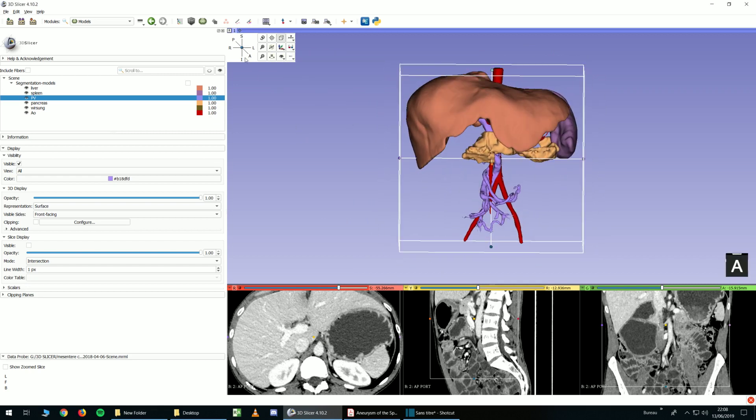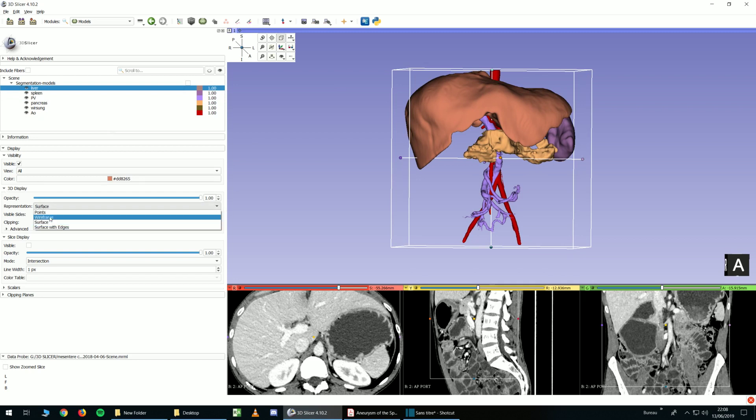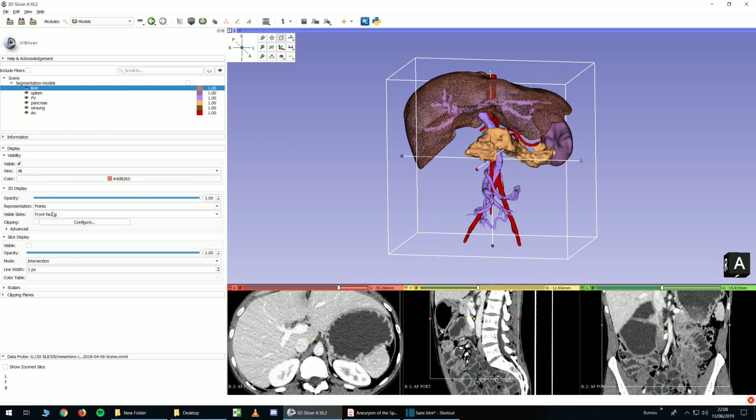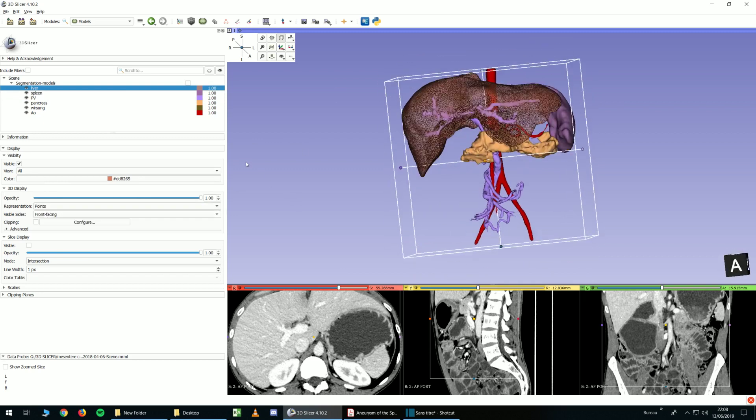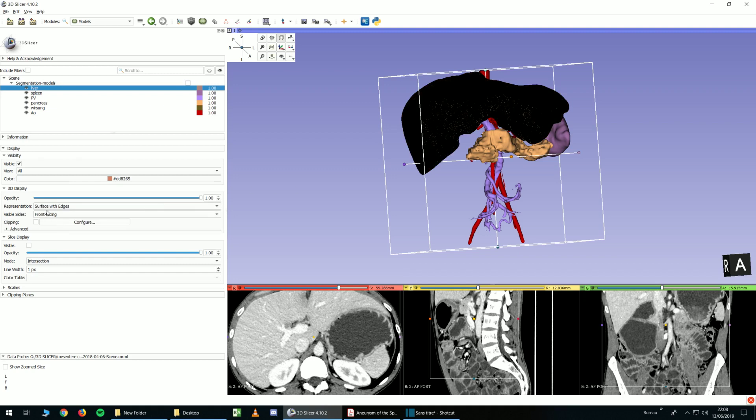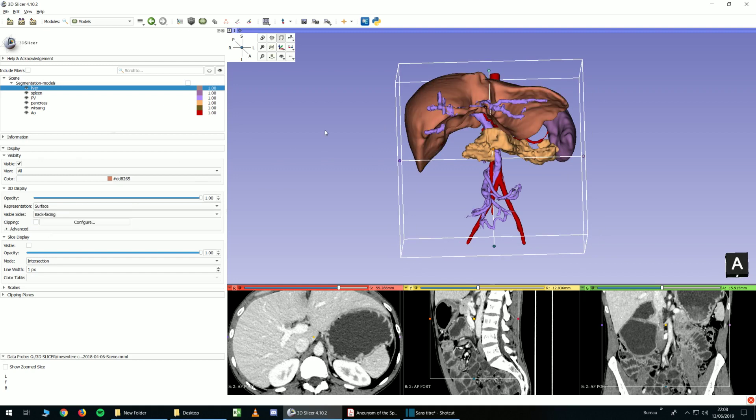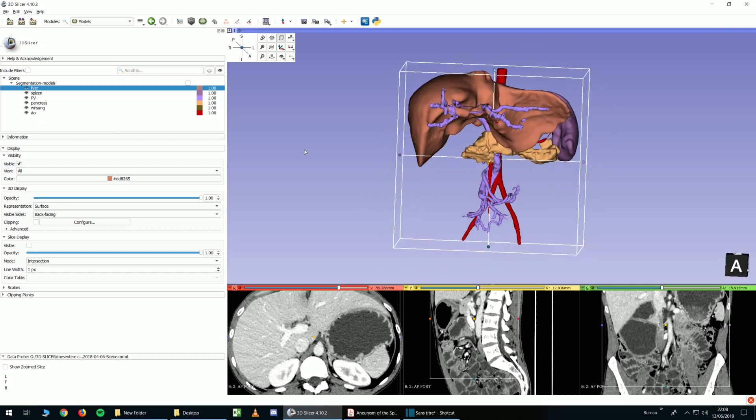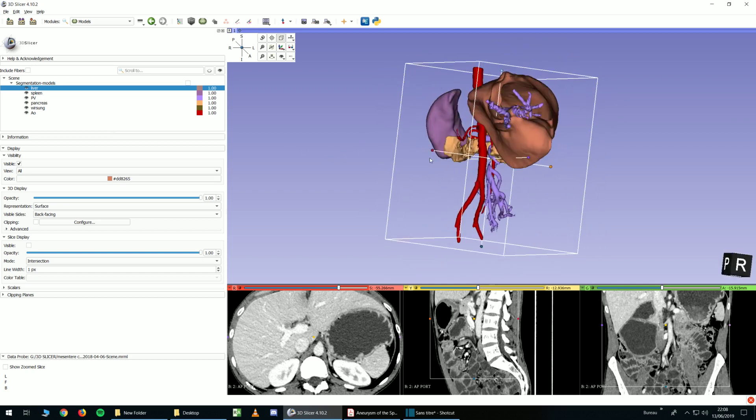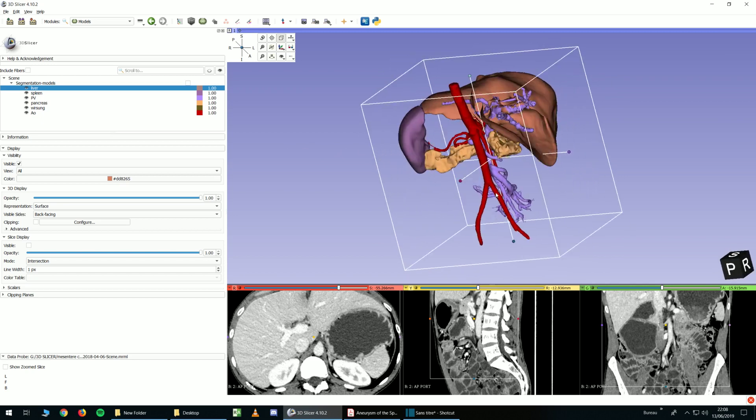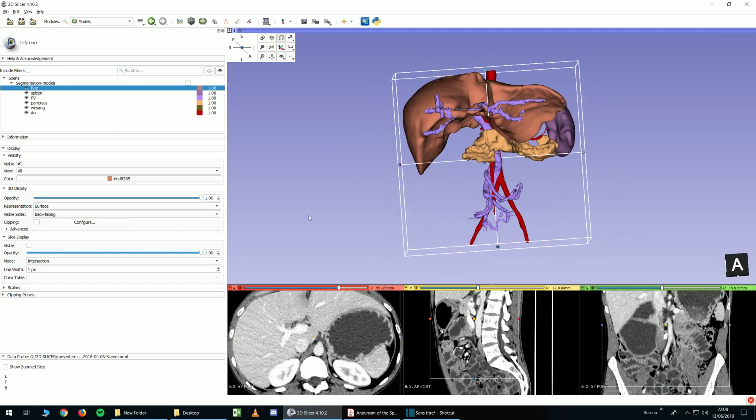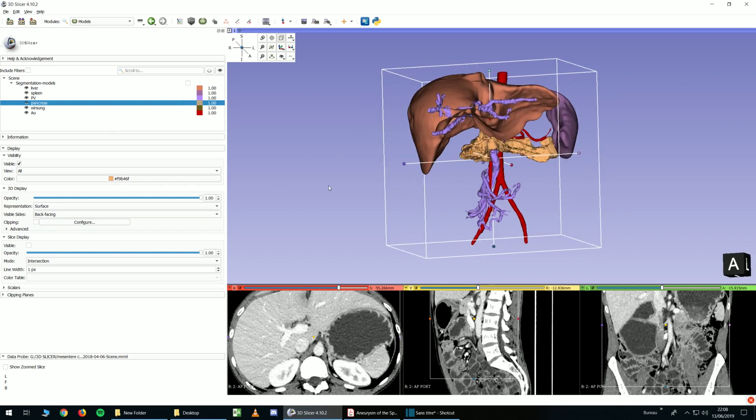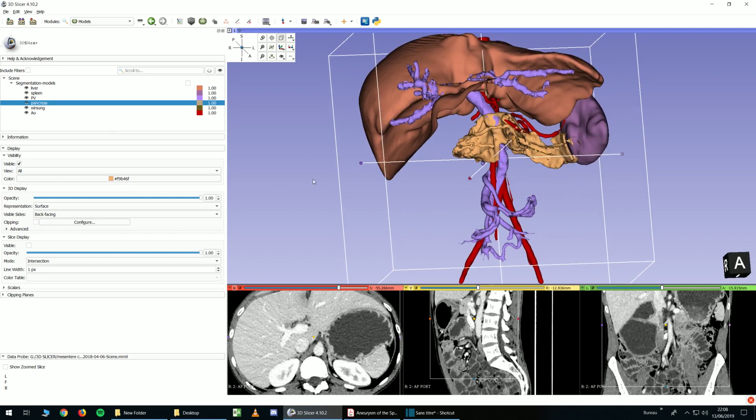And one interesting thing is, I think, you can change settings right here. For example, you can set points if you want. But it's not very useful. But what is nice is that you can change the front, you can set it on front facing or back facing. And you will have this kind of view if you want to see the inside of the object. It can be nice for maybe the pancreas to see the versung duct. You can see here, the versung duct.